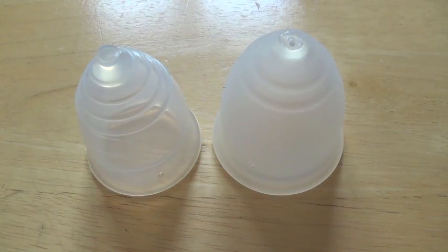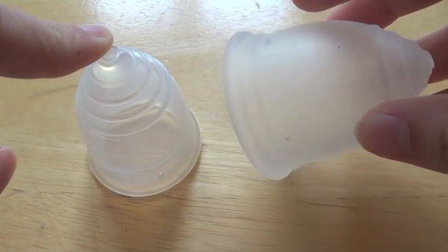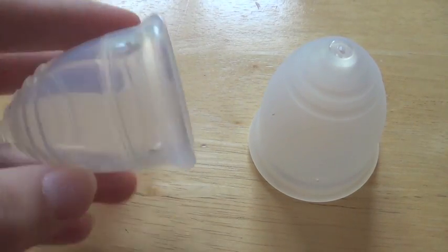Hey guys, it's Bree. So today I'm going to be comparing two menstrual cups: the Rubik Cup, which is a one size menstrual cup, and the Yuki Cup Small Soft.